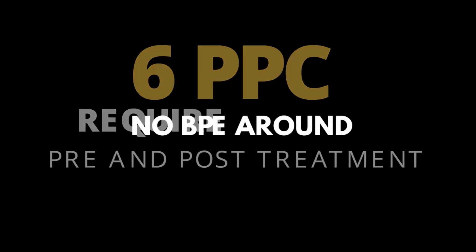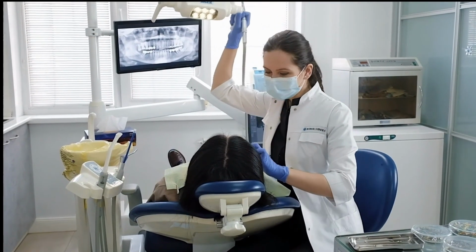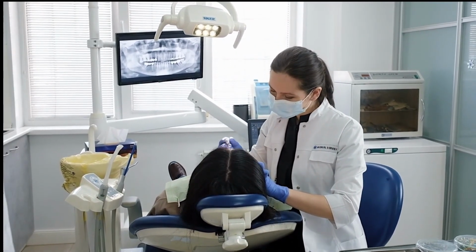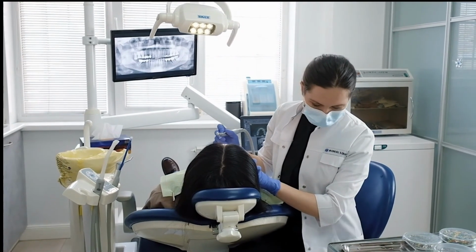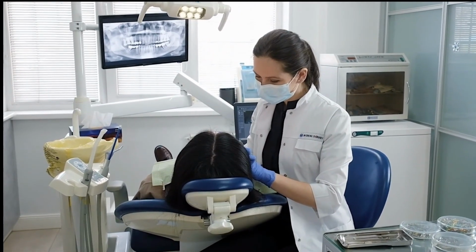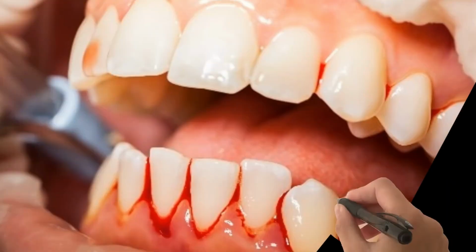As an adjunct, radiographs should also be taken for patients who have BPEs of 3 and 4. The radiograph should be able to determine the crestal bone levels, and most commonly, periapical views will be required for patients with BPE scores of 4. Bleeding on probing should also be recorded in conjunction with a 6-point pocket chart.